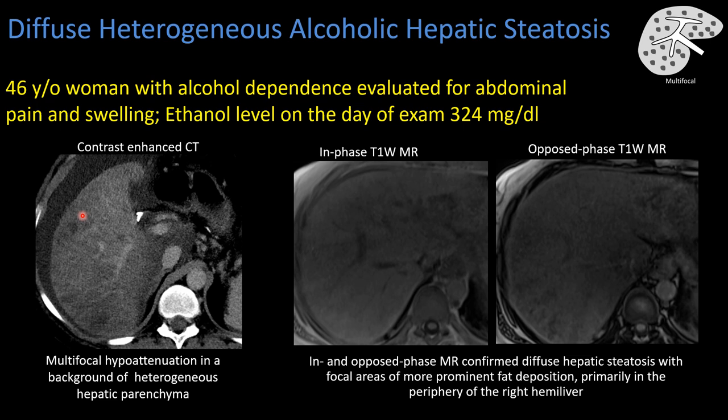The liver overall is decreased in attenuation relative to the spleen, with even more focal areas of hypodensity in the hepatic parenchyma. When we look at this same patient on MRI, we see diffuse steatosis but in addition these nodular, irregular patchy areas of more severe steatosis superimposed on that background of diffuse steatosis.